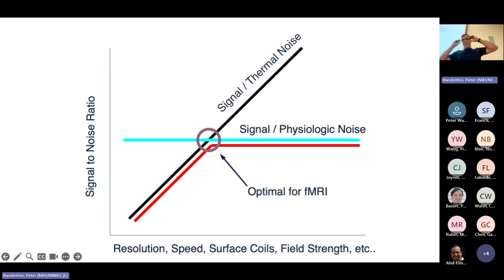People have tried, and to this date, people have tried to filter that out, to create filters for the cardiac function or for respiration. And oddly, it doesn't work that well. I mean, there's RETROICOR, there's other things. They might push this curve up maybe 10%, but it doesn't get rid of it.